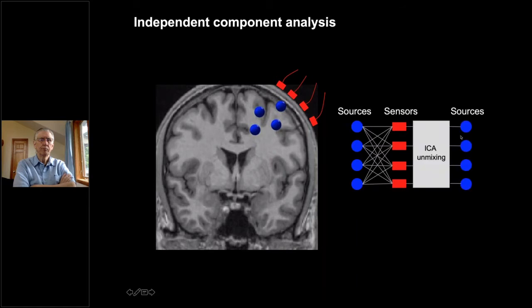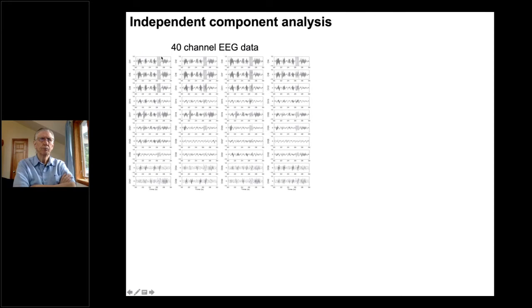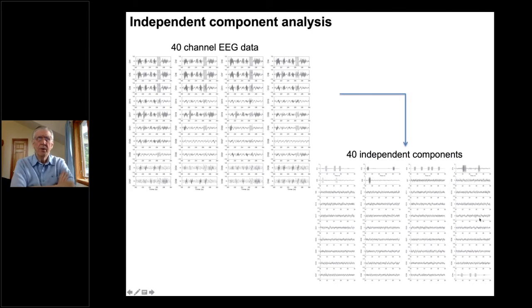I'll go into a little bit more detail for this group than usual, but you don't need to pay attention to all of the individual signals here, but just imagine each one of these is a recording from an EEG electrode. If we have 40 EEG electrodes overlaying the scalp, each one of them will be getting all of the signals, including motion artifact. This is collected during phantom head motion and the bursting activity depending on its proximity to the source. Typically what we would do is put that channel data into ICA and ideally we're going to get a bunch of noise sources back and also our ground truth sources that might be spread out. So what we wanted to do was compare how can we possibly improve this, especially in conditions where we have a lot of motion artifacts.